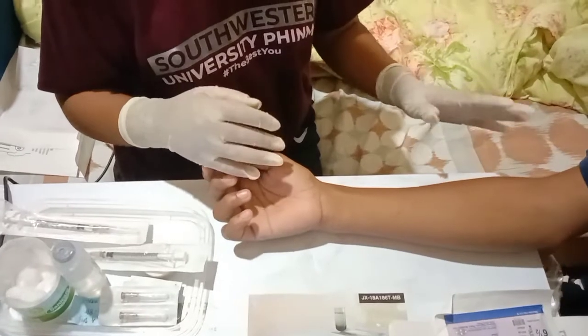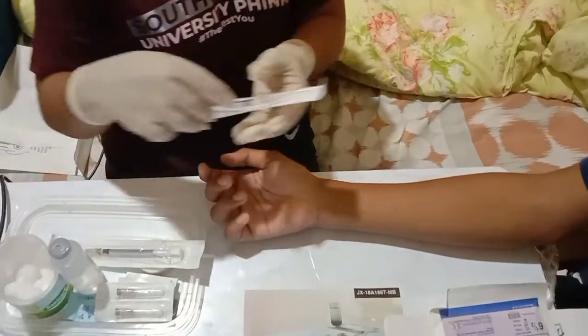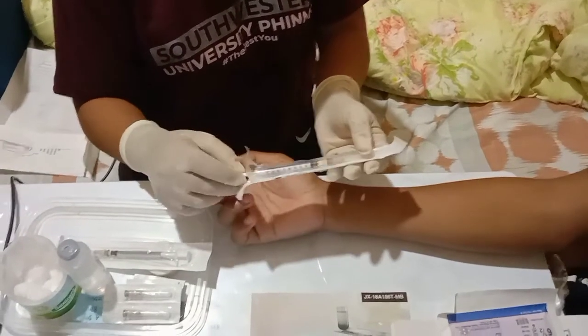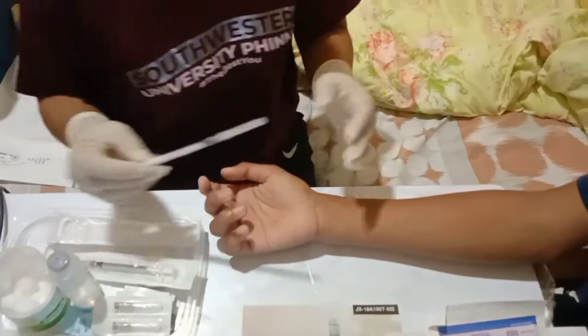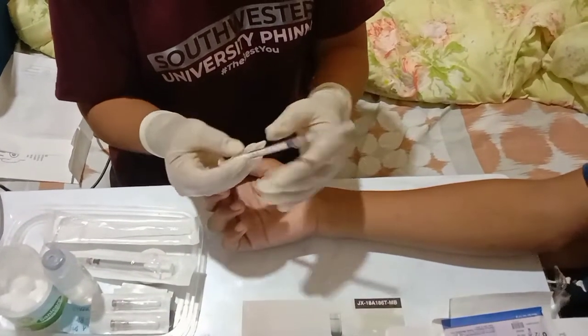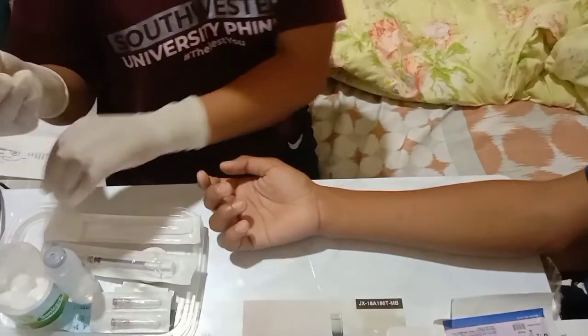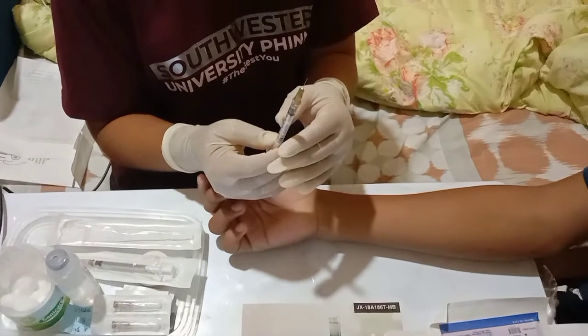After the area is dry, prepare the syringe for the injection and remove the needle cap while waiting for the antiseptic to dry. Expel any air bubbles from the syringe.